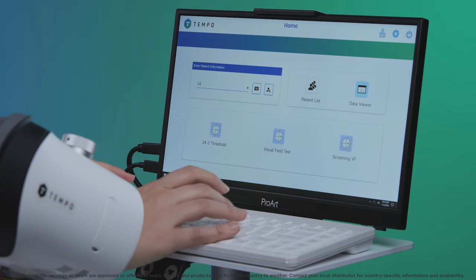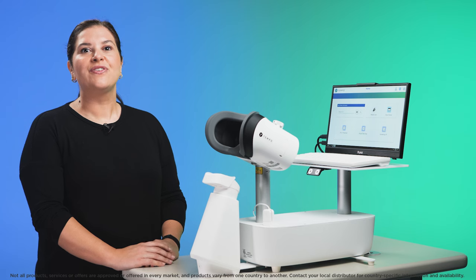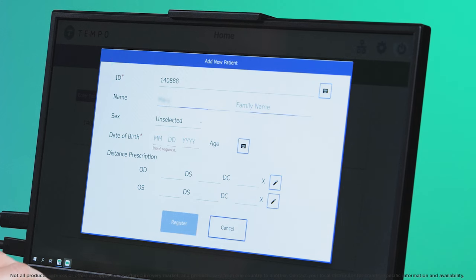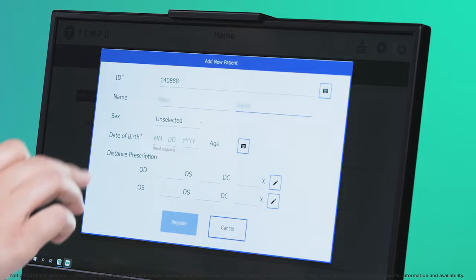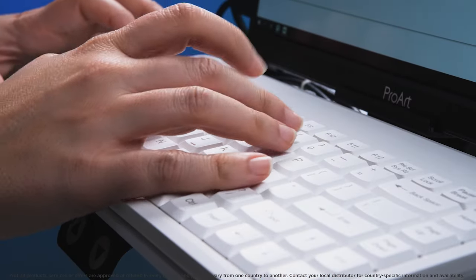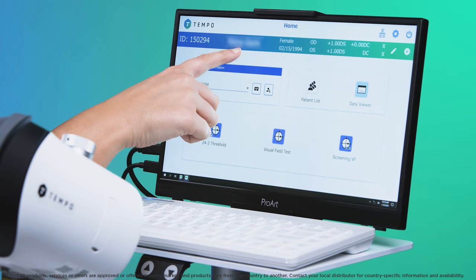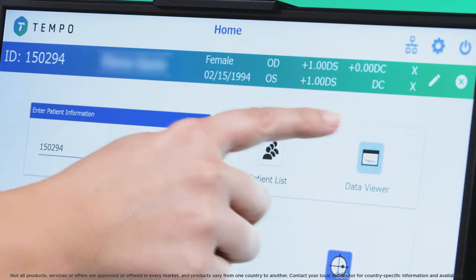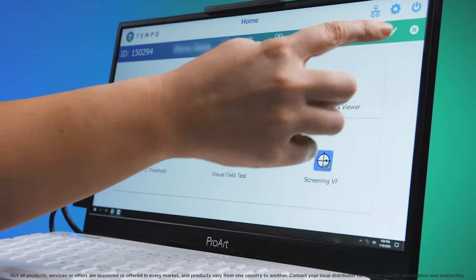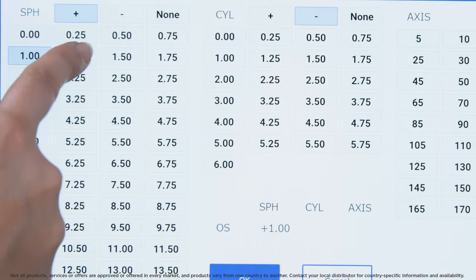To get started, add patient ID and press enter. For new patients not already in the database, you will be prompted to add new patient. Enter their name, date of birth and distance prescription and select register. For patients already in the database, adding their patient ID will display their distance prescription. If this has changed significantly since the last visit, use the pen icon to update.